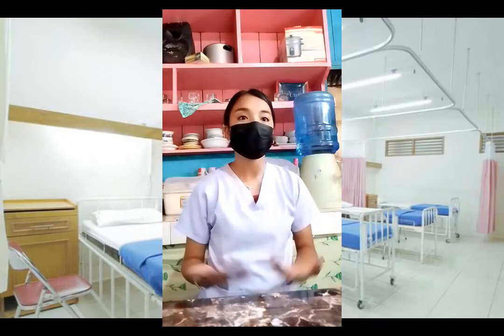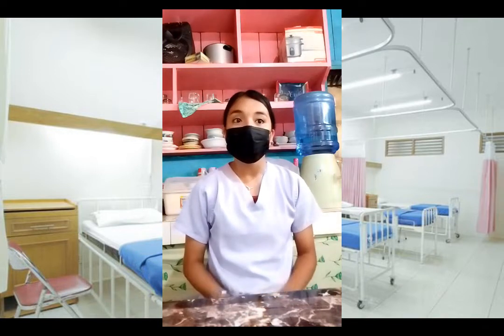We also have the equipment and materials. The first one is a container with warm water, and the second is soap, a washcloth, and antiseptic swab or cotton balls, then the sterile specimen container, the label for the container, the bedpan, and the last one is non-sterile gloves.